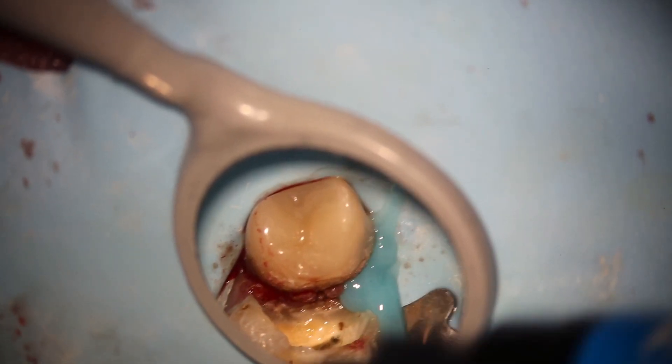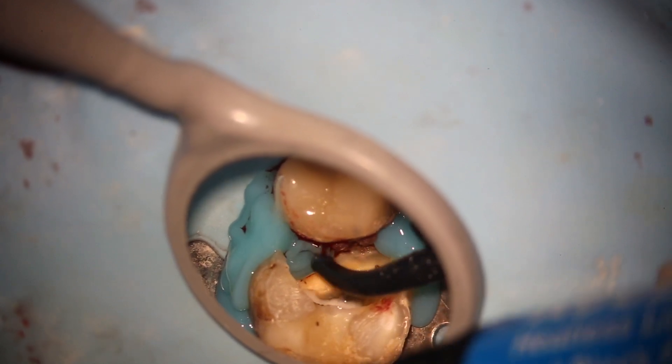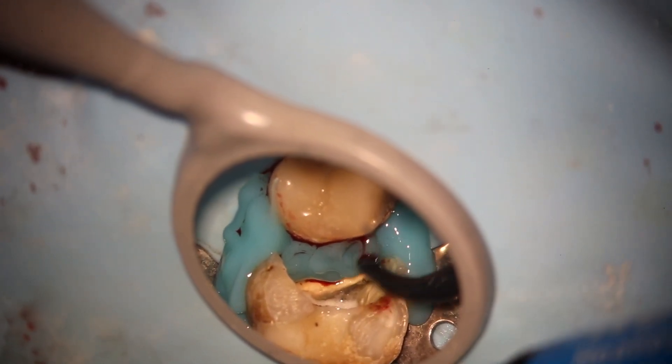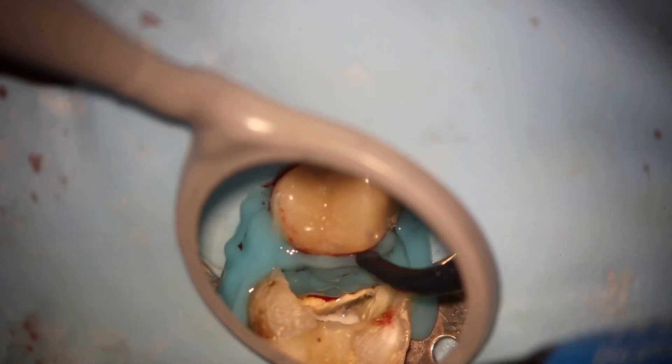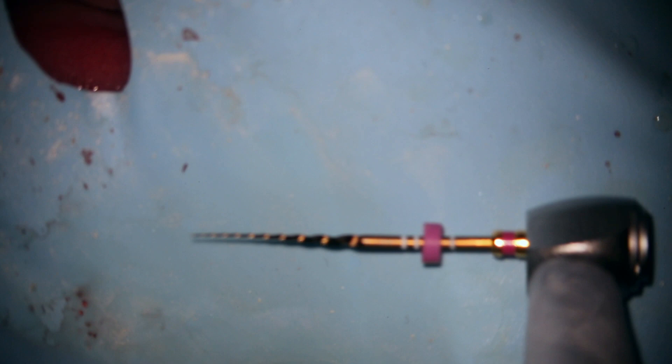I'm going to build a temporary mesial wall with a rubber dam light-curable sealer called Cool Dam. You could use Liquid Dam or Cavit, but this is so easy — the time cost is just 30 seconds. Build a temporary mesial wall; if you wanted you could do a buildup now too, but just light-cure Cool Dam from PulpDent for 20 seconds and you've got a nice temporary mesial wall — a little swimming pool to keep the bleach in.